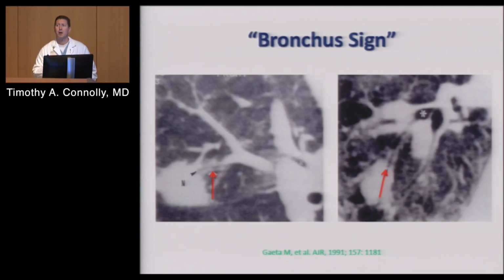Super dimension bronchoscopy. It's electromagnetic navigation bronchoscopy. Super D is just the company name. It's easier to say.